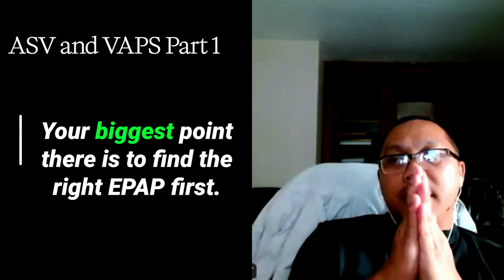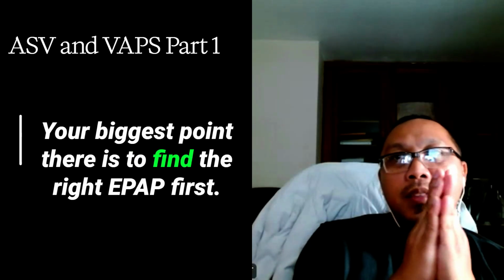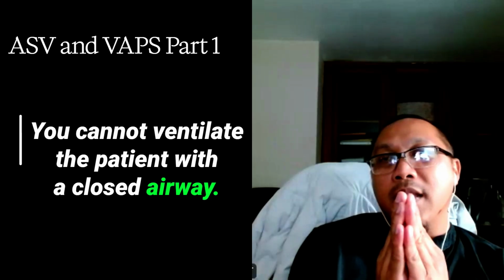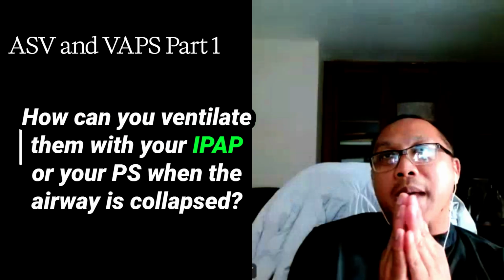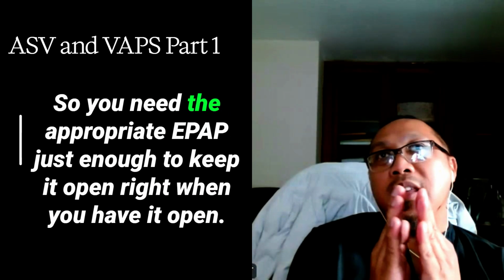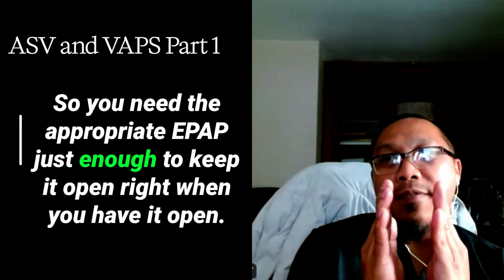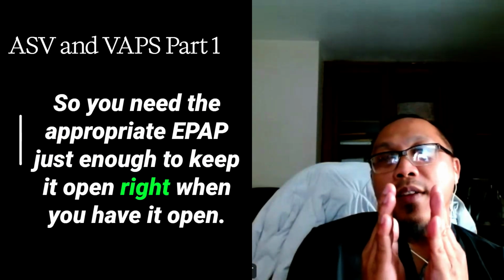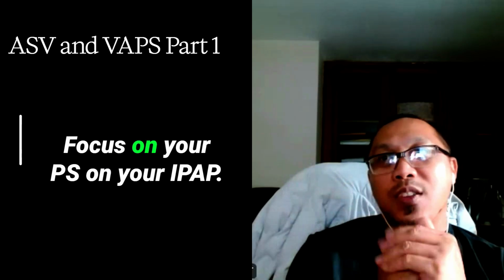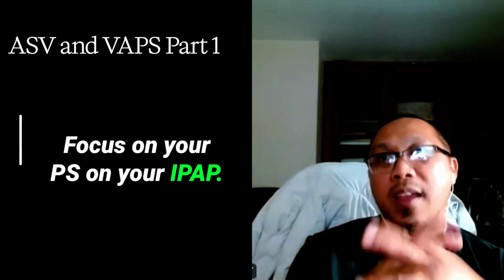Okay. Your biggest point there is to find the right EPAP first. Why? You cannot ventilate the patient with a closed airway. How can you ventilate them with your IPAP or your pressure support when the airway is collapsed? So you need the appropriate EPAP, just enough to keep it open, right? When you have it open, don't increase it anymore. Focus on your pressure support, on your IPAP.